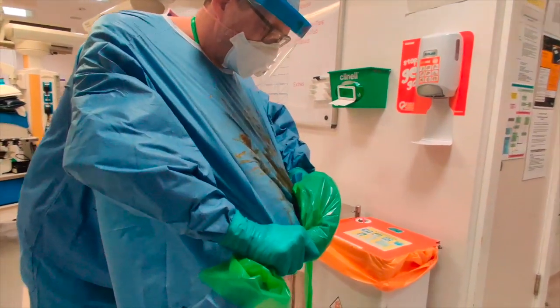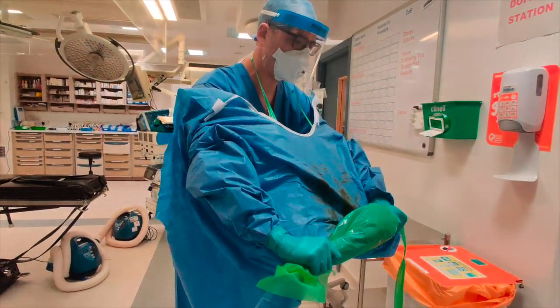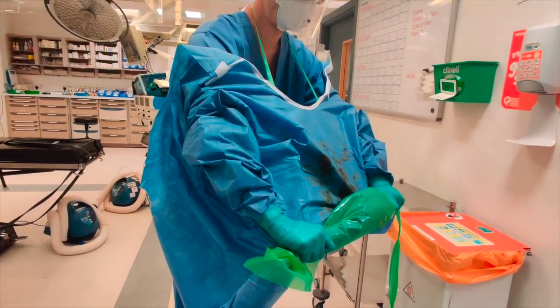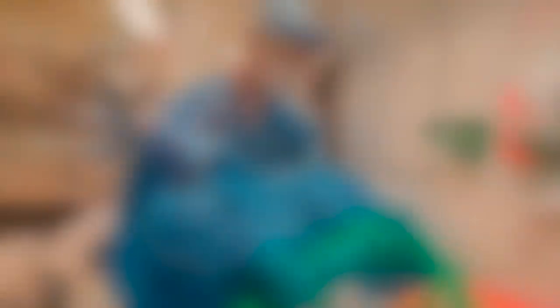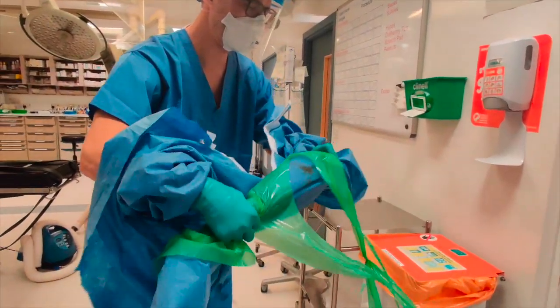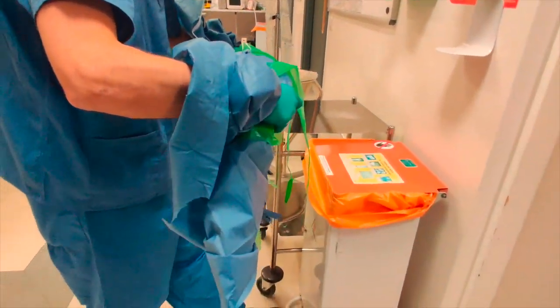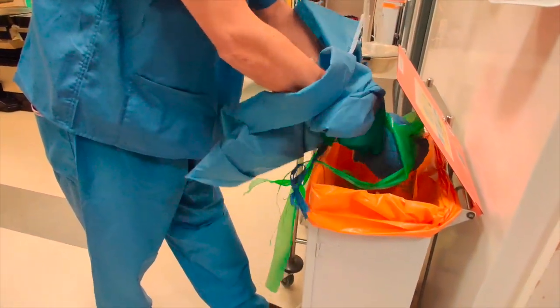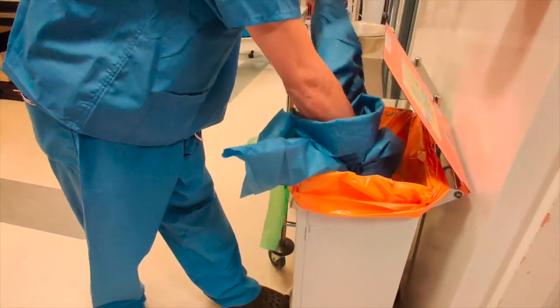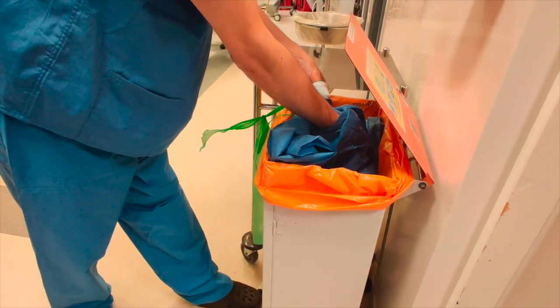I'm going to continue to bring this up into a roll. If there is a stretch in the gown and you can't get the plastic off because it won't pull, don't keep pulling — ask your buddy to come and help you. I'll continue rolling and then come to the bin, open the bin, and put the whole bundle carefully and directly into the bin, being careful not to touch myself.